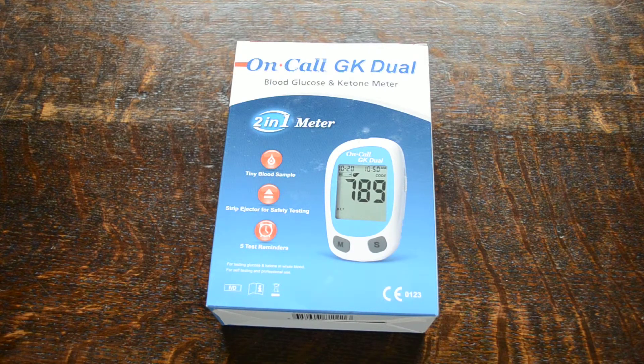The meter system has a very large 450-reading memory function built in, which is great for people wanting a long record of their blood glucose or ketone levels. A lot of these meters are selling to people who want an accurate way of measuring blood ketones, as opposed to doing both glucose and ketones. It's one of two meters on the UK market with that ability, and we're selling 25 ketone test strips for £16.95, giving very good value for regular blood ketone testing.